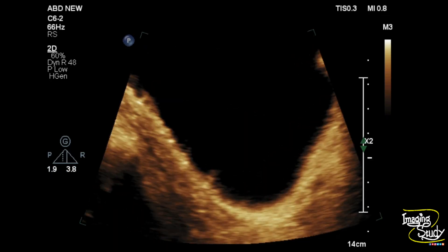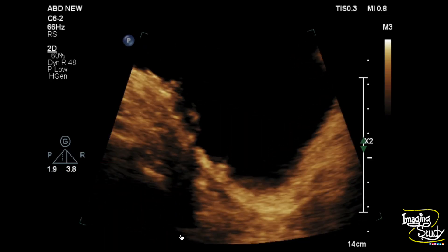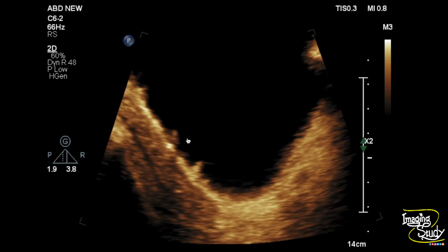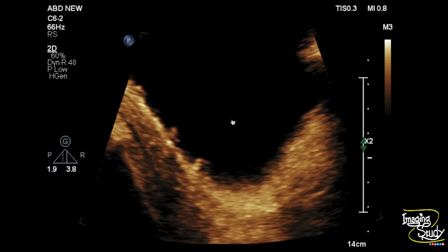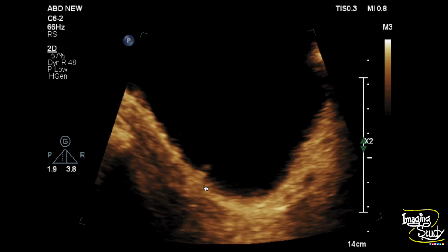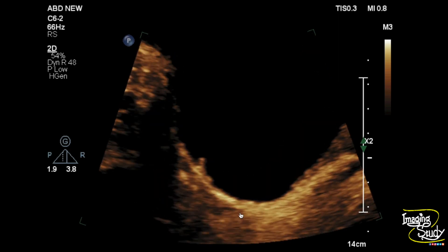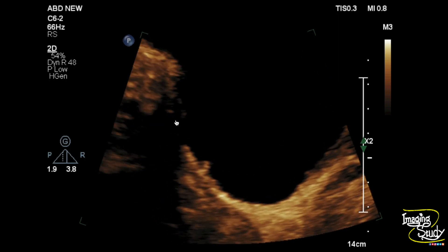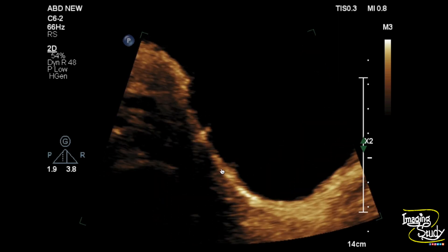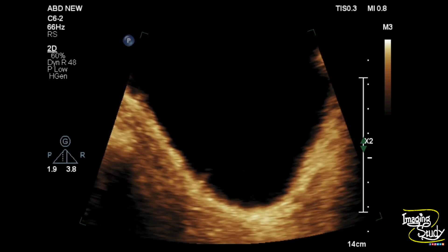Here we have decreased the gain and you can see the debris more clearly. Now we want to focus more on the urinary bladder wall, and you can see there are multiple areas of irregularity.